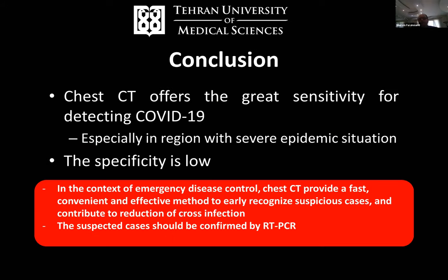And finally, I want to conclude that chest CT offers great sensitivity for detecting COVID-19, especially in regions with severe epidemic situations. But the specificity is low for CT scan. Maybe, for the reason that I mentioned before, we underestimate the specificity, but we have to accept that the specificity of CT scan is low.